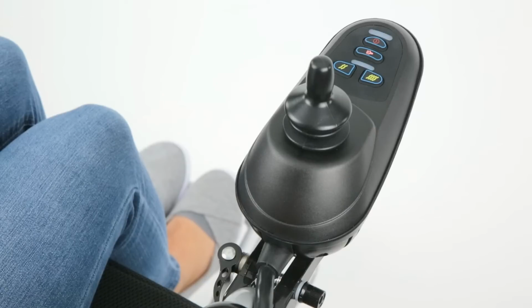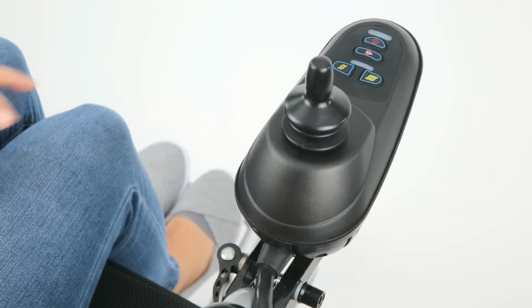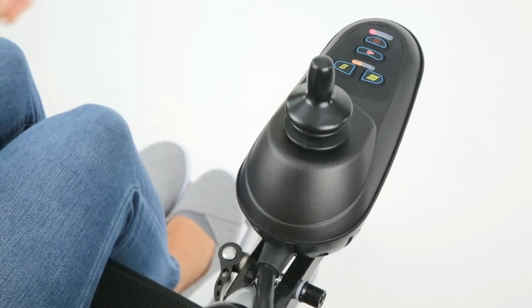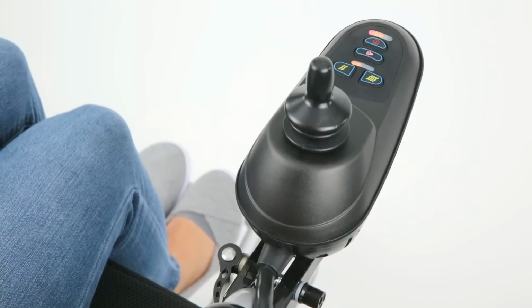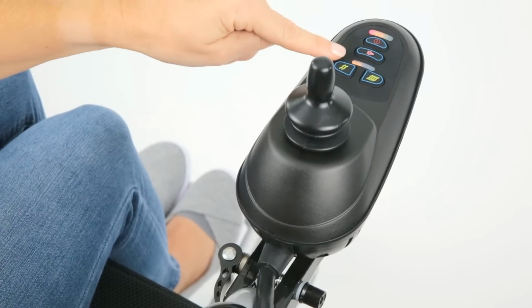Before using your wheelchair, make sure your seatbelt is fastened. To power on the device, press the power button. The device will beep and indicate the battery level on the top and the speed level on the bottom.